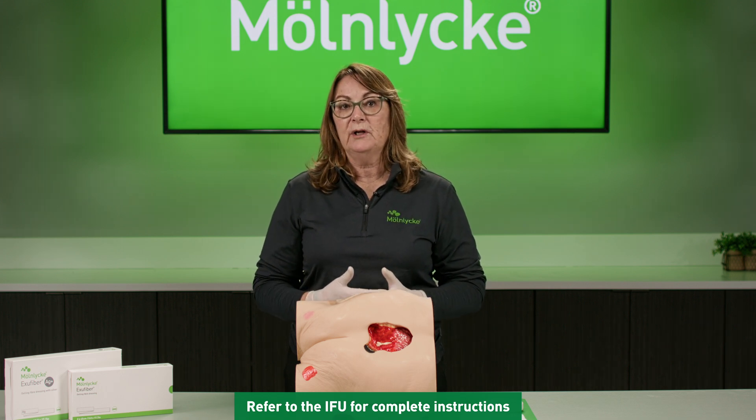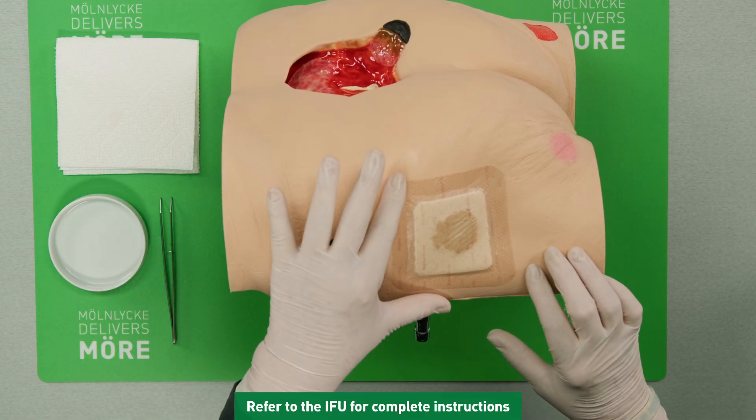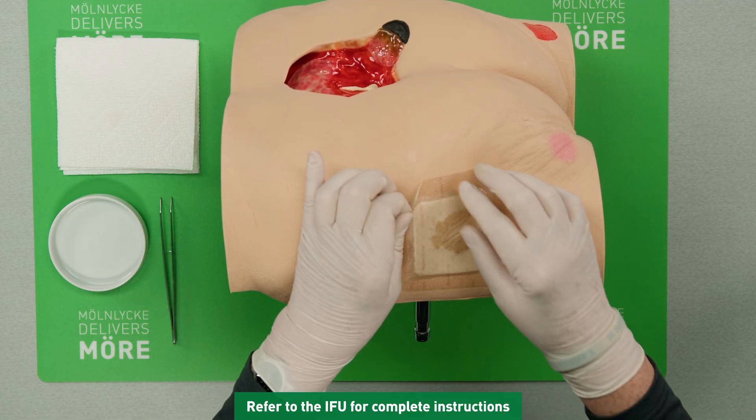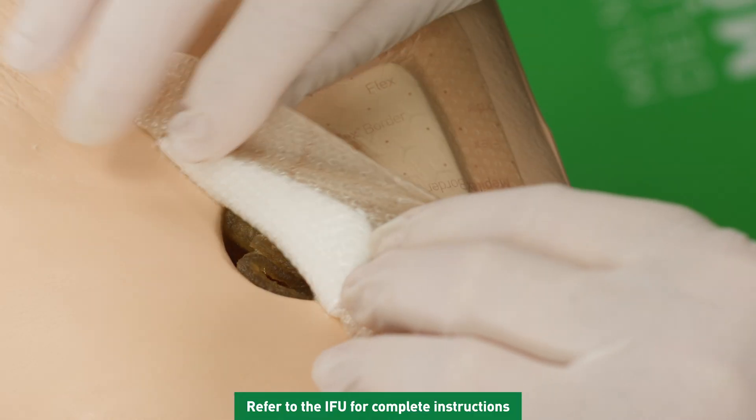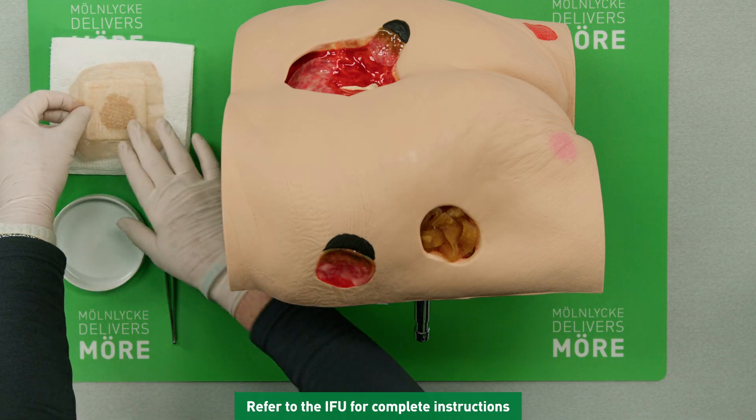Now I'm going to demonstrate the removal of these dressings. To begin with, I'm going to roll this edge here and then gently pull on this secondary dressing. Place that on the side.